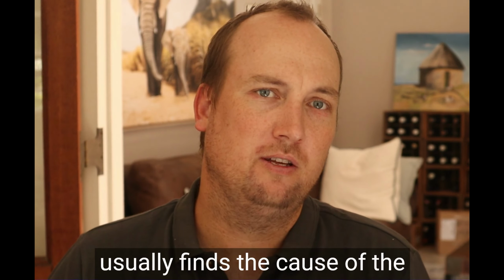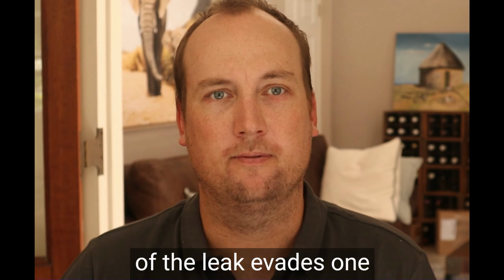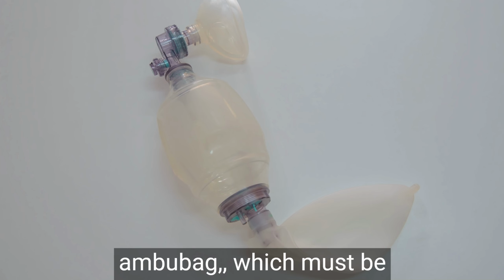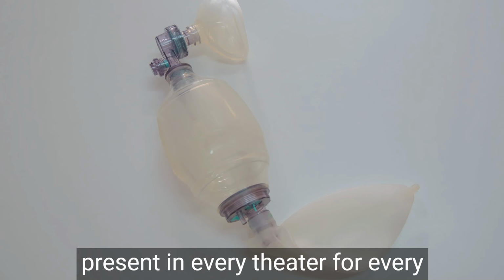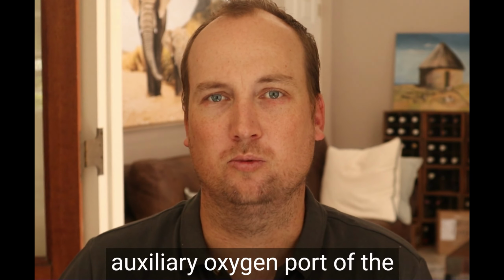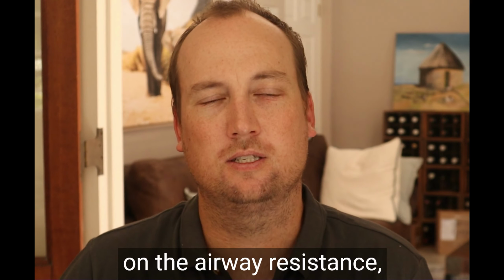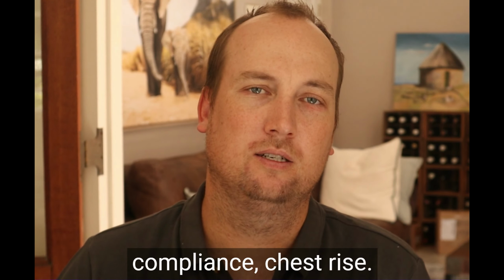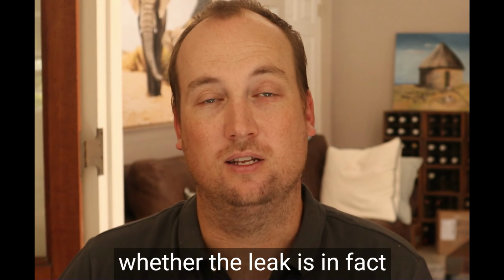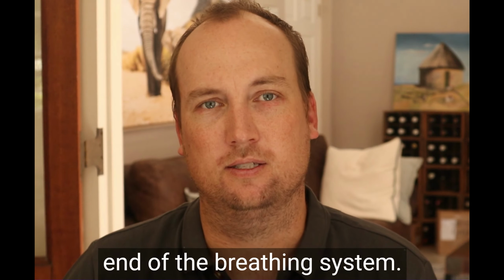In my experience, one usually finds the cause of the leak fairly quickly and one can correct the issue quickly. But occasionally the cause of the leak evades one, and then I use the emergency AmbuBag, which must be present in every theatre for every anesthetic, to ventilate the patient, and I connect it to the auxiliary oxygen ports of the anesthetic workstation. Using the AmbuBag like this rapidly gives me information on the airway resistance, compliance, and chest rise. It also helps me to work out whether the leak is in fact coming from the airway or the patient end of the breathing system.